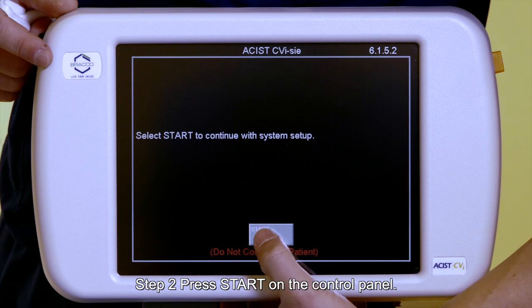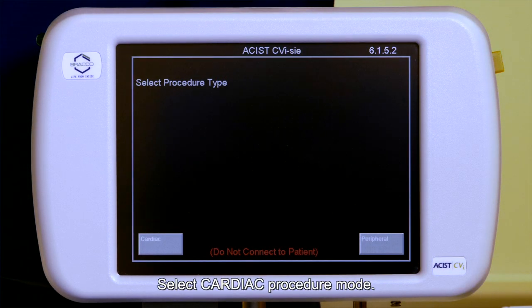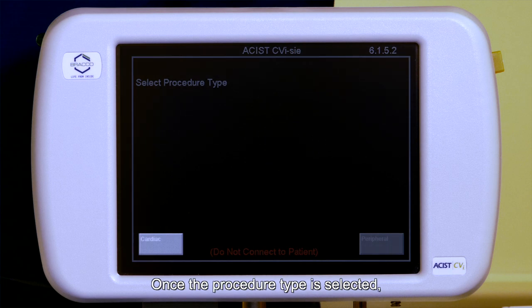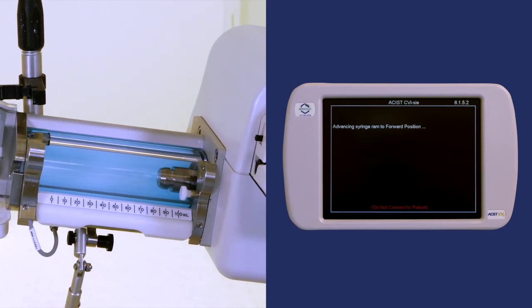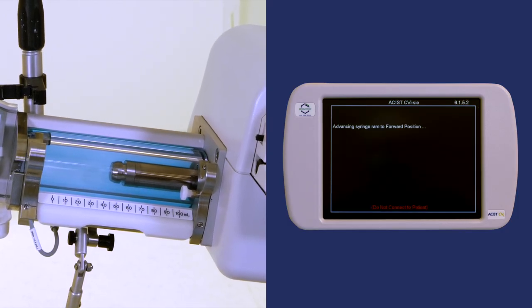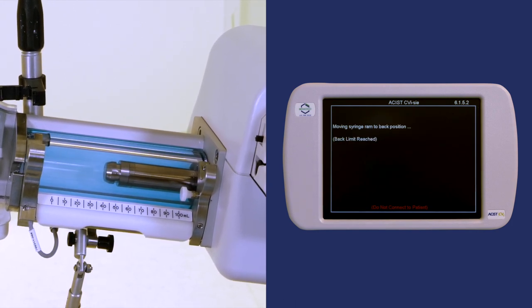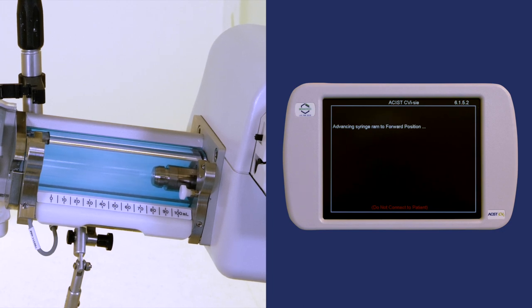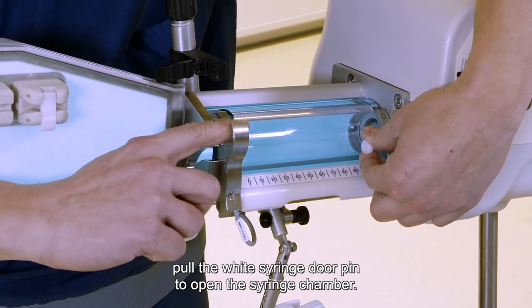Step 2. Press Start on the control panel. Select Cardiac Procedure Mode. Once the procedure type is selected, the CVI system will perform a routine in order to calibrate. Step 3. Following the instructions on the screen, pull the white syringe door pin to open the syringe chamber.